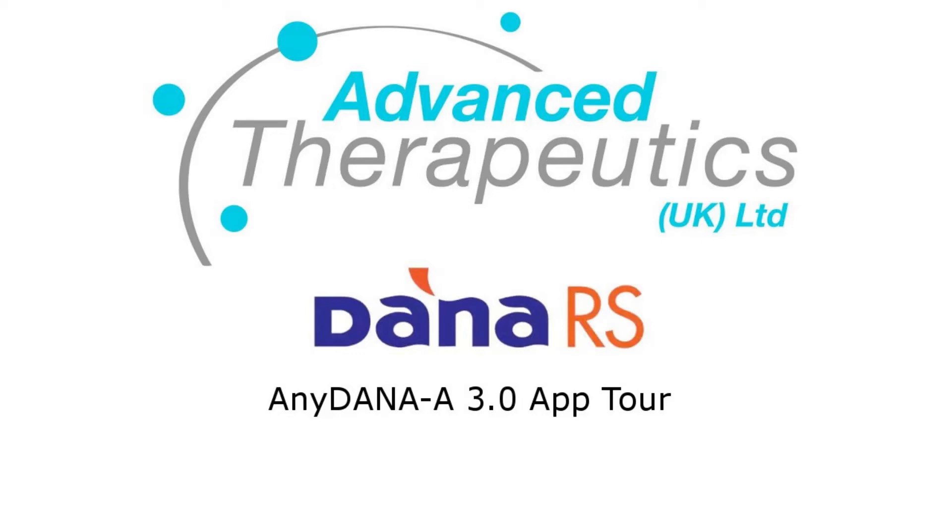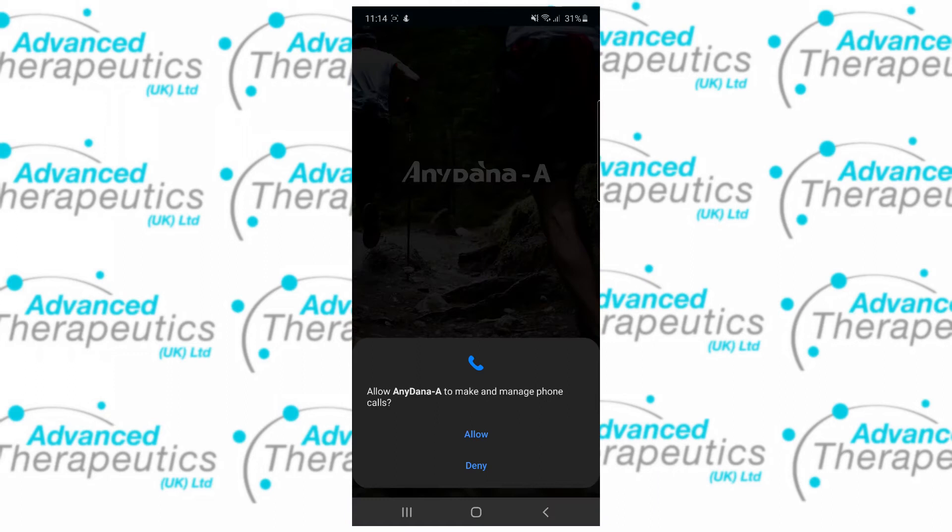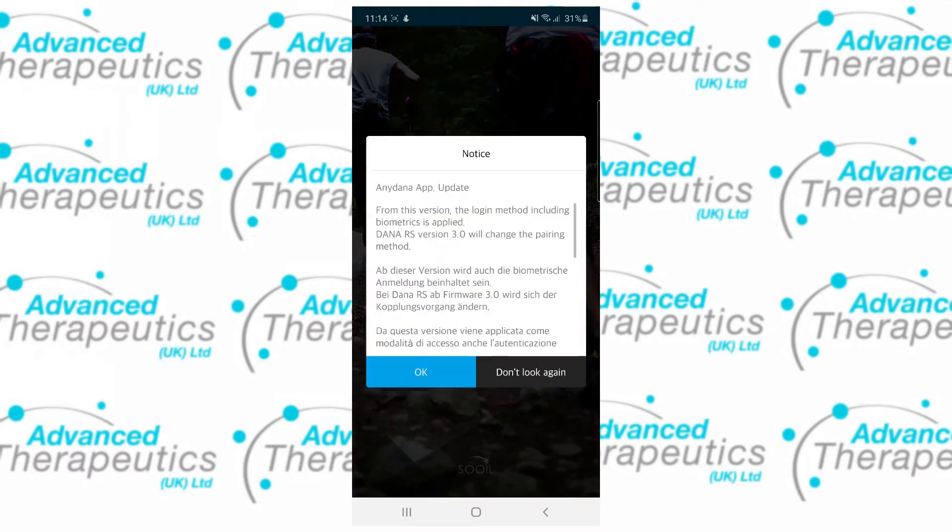Hi, welcome to an introduction to the AnyDANA-A 3.0 mobile application for use with the DanaRS. Upon installing the app and opening for the first time, make sure to allow all the permissions the app is asking for and ensure your Bluetooth is on.